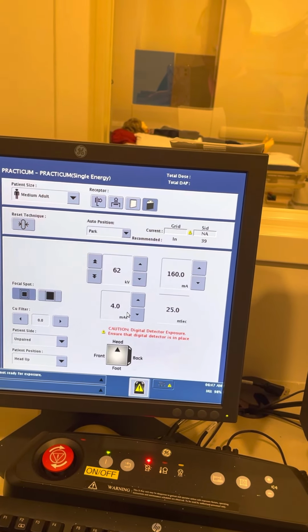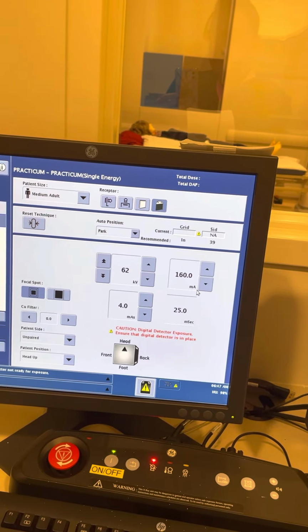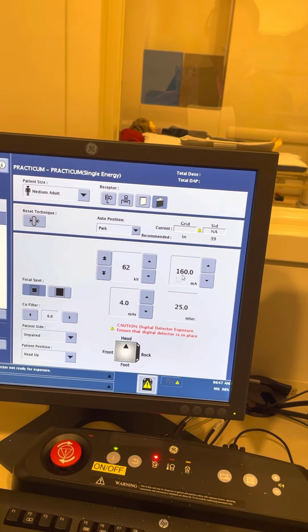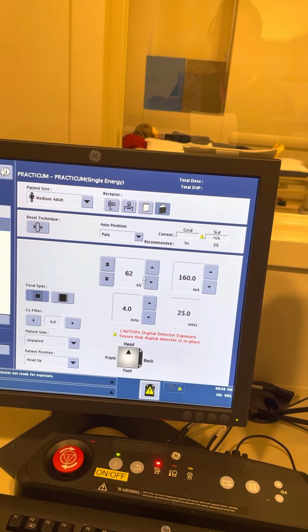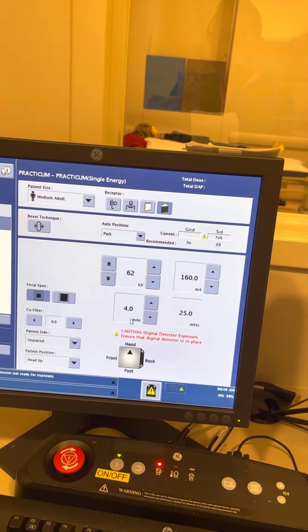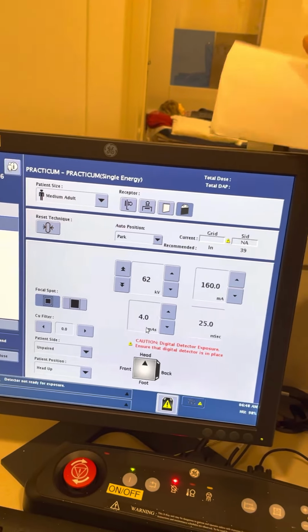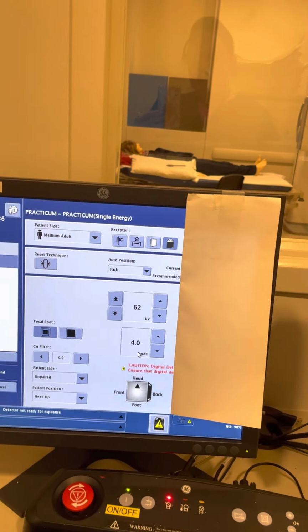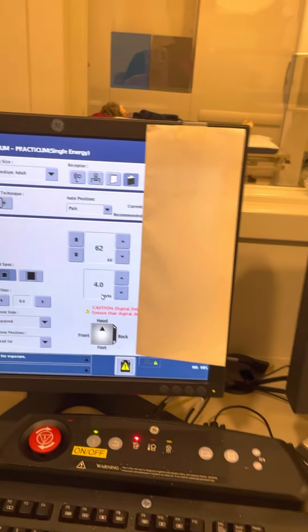Okay, I want you to notice that there's a mAs and then there's an mA. Sometimes students will set kVp and mA rather than setting kVp and mAs. But the things that we're asking you to set are, well, three things: the receptor, kVp, and mAs. Okay? We do sometimes have this covering that section over there, but just remember it's all going to be in line right in the center. That's what you need to focus on.